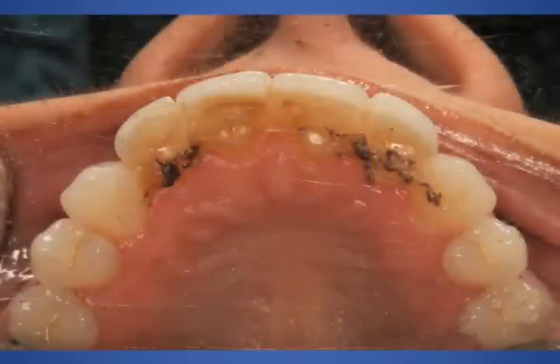This view shows the palatal aspect, and you can see that a dentist had splinted those 4 anterior teeth to her cuspid teeth to give her some stability, but those teeth were fairly mobile.